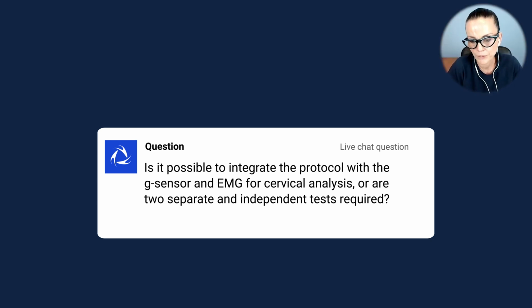And Marta, in my opinion, it's very important to add also the muscle assessment, because as I have explained, the kinematic values are the result of something that happens in our muscles. So through the kinematics we measure the result, but if we want to assess the cause, we have to evaluate also the muscle behavior.